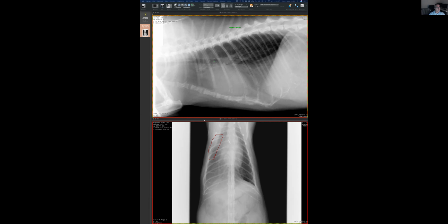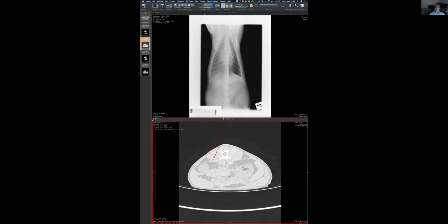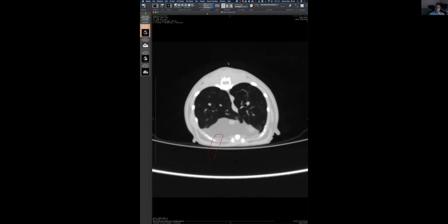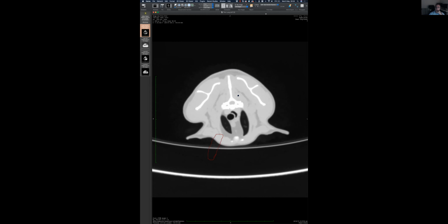And it's going to come in this shape. Okay. I don't know if this is the best. Let me go there. Okay. So I go cranially all the way, and then we come caudally. I'll run it slowly. I will share the link, so then you can take a look at this case carefully. I'm going to run slowly, and I'm also interested in you commenting on the CT.